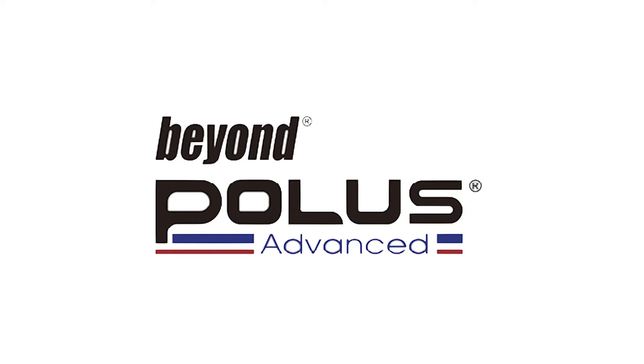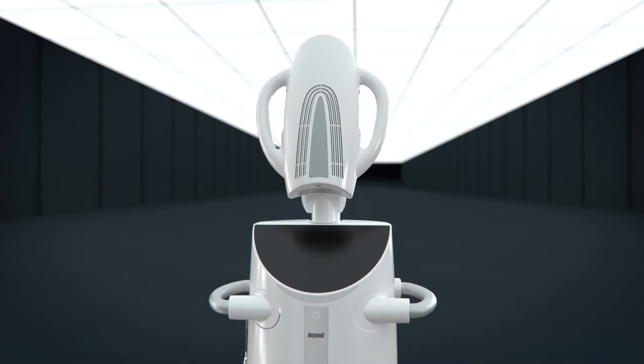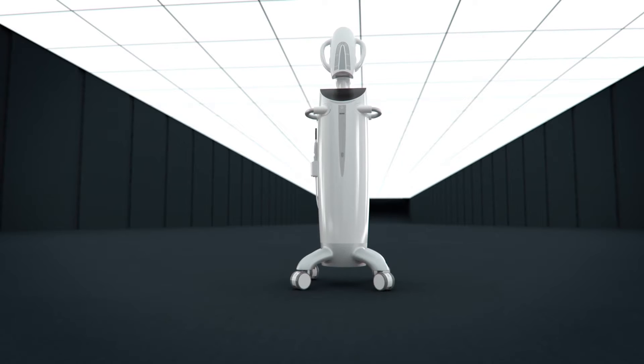Beyond International, global leaders in aesthetic dentistry, is proud to announce the award-winning Polus Advanced Teeth Whitening Accelerator, custom designed to deliver the ultimate whitening experience.